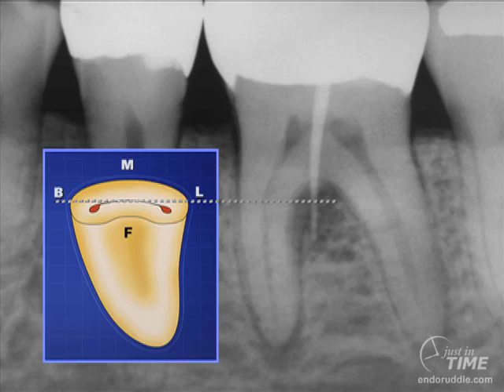But if you look carefully at the cross section, I want to bring to your attention on the left would be the correct method. That would be brushing and relocating the canal away from the furcal concavity. It means that there'd be more residual dentin and the canal would be more centered in the mesial dimensions of the root. If you look at the shaded gray area on the right, you'll notice that although we're perfectly circumscribing the canal, the preparation is definitely much closer to the furcal surface of the root, and this is the danger that we spoke about.